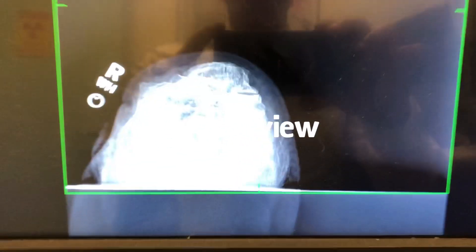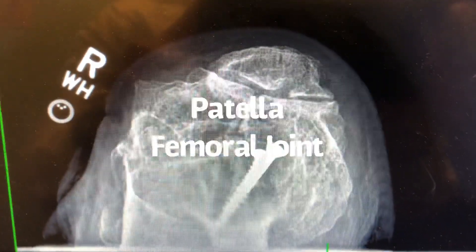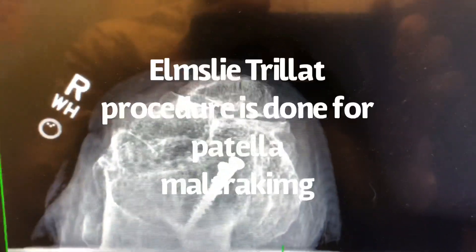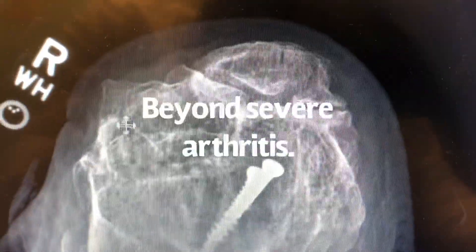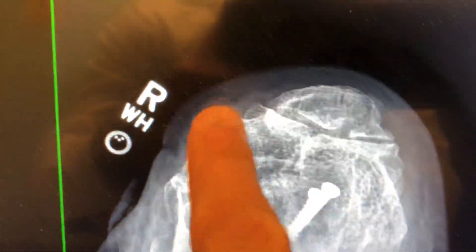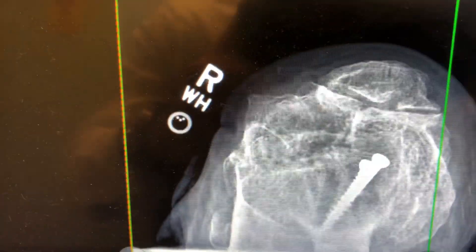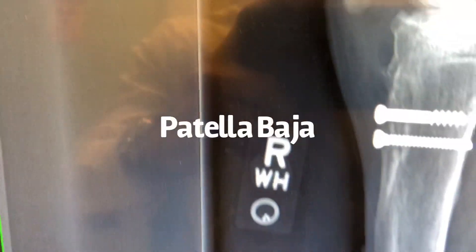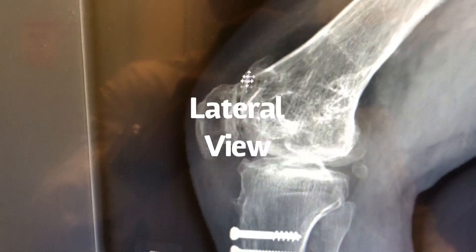Here we go. I am at the x-ray tech station looking at my sunrise view. You can see my old screws from my Elmslie-Trillat tibial tubercle surgery that I had at Shriners Hospital many years ago. You can see the patellofemoral joint is somewhat destroyed — you really don't see a sulcus. My patella used to track over there, then they did the medialization. Not much joint space at all. The lateral view shows patella baja, old screws, osteophytes.